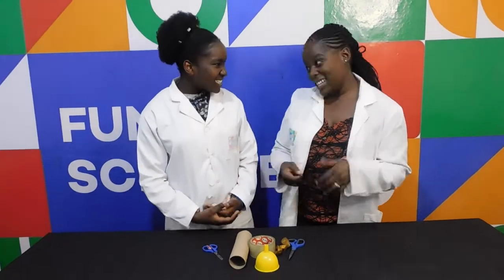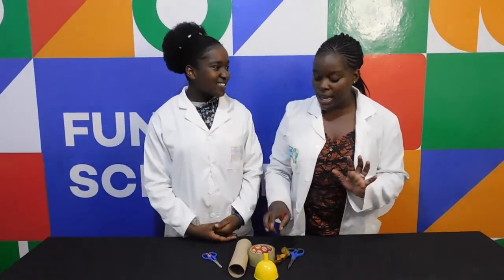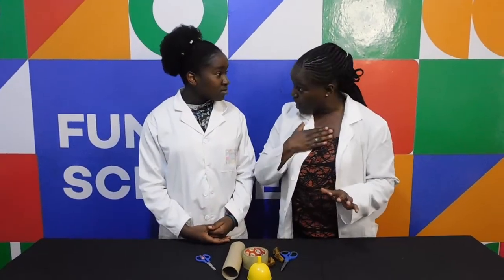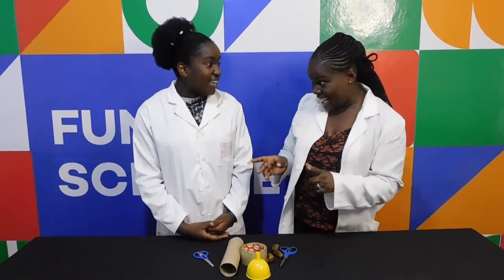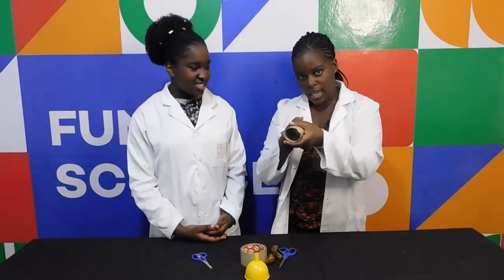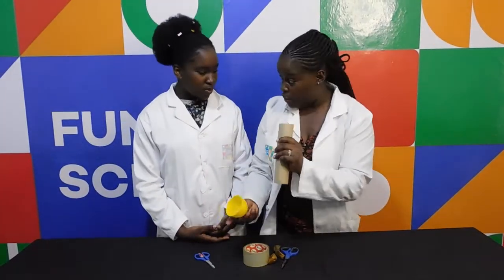So Nelly Welling, ready to start? We're going to make a device that you can use to listen to your heart — listen to your heartbeat! So what we're going to do, we're going to take our toilet roll. This is like a cardboard roll of paper.